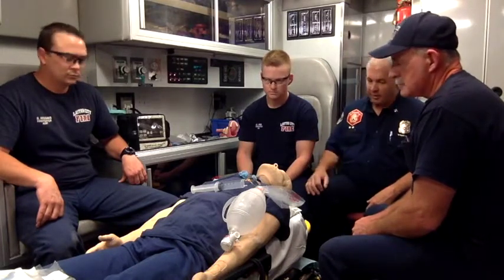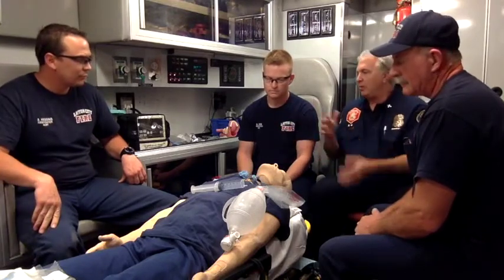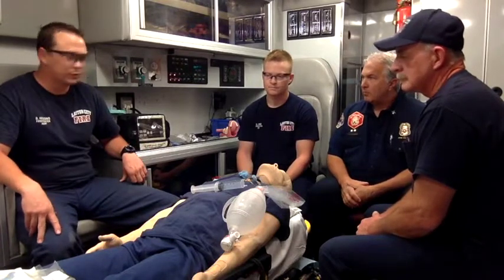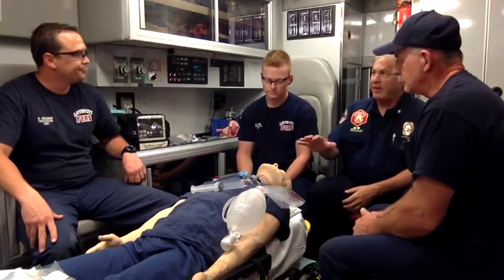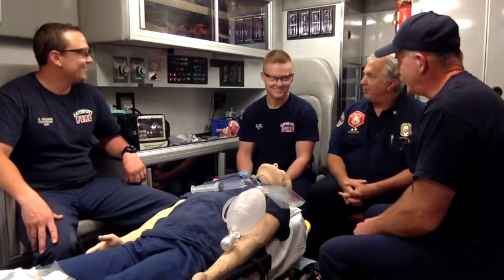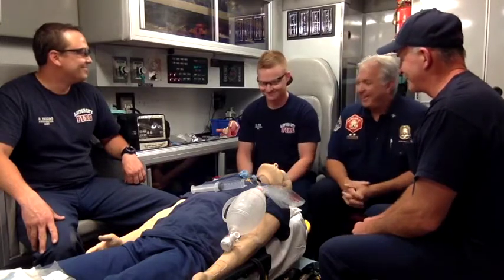So, Bud, first of all, who should use this? Who's going to use the King Airway? All of us, the advanced EMTs and paramedics, we all have places and needs for them. Okay. So it's not just an advanced thing? No. What do you think? I agree with Bud.